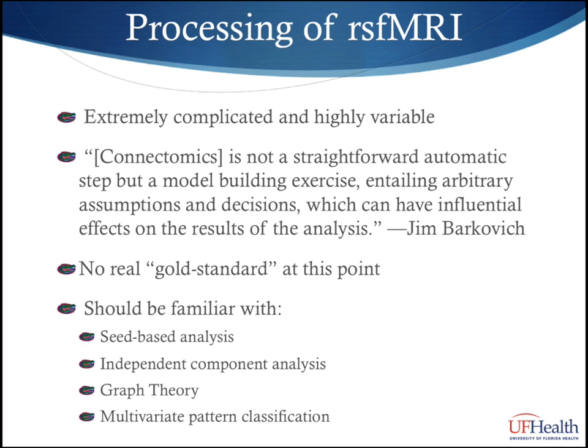So as we encounter with DTI, the processing of resting state functional MRI is extremely complicated and highly variable. I show a quote from a paper by Dr. Jim Barkovich's group in which they said, "Connectomics is not a straightforward automatic step, but a model-building exercise entailing arbitrary assumptions and decisions which can have influential effects on the results of the analysis." What they mean by this is that there's really no gold standard on how we acquire and process this data, and many assumptions are made along the way.